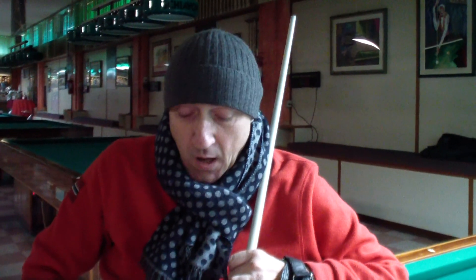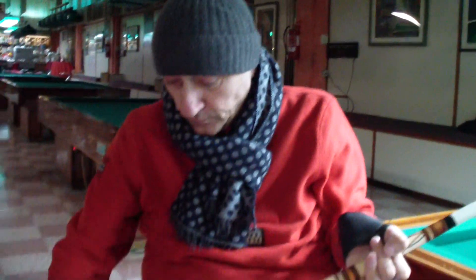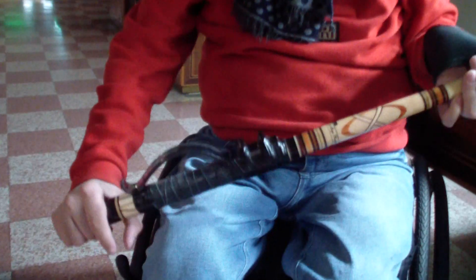Amici, we are here in the billiard room, which is located in the LASER, because we want to talk to you about an auxiliary device which I created and produced.